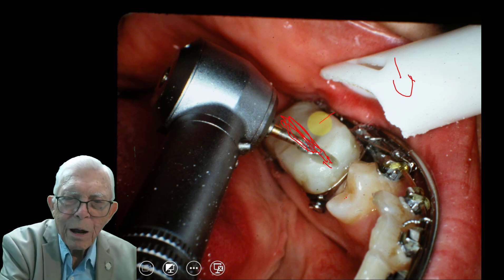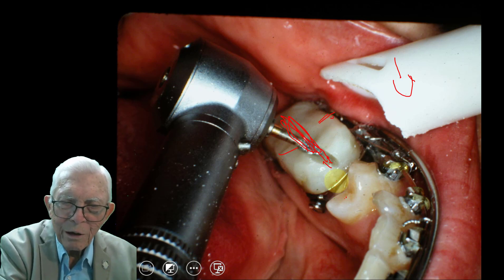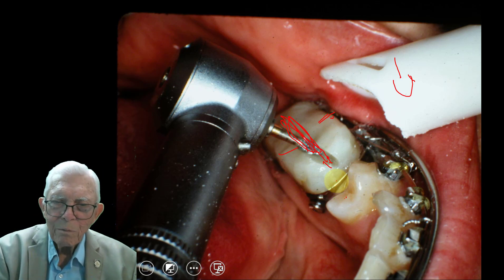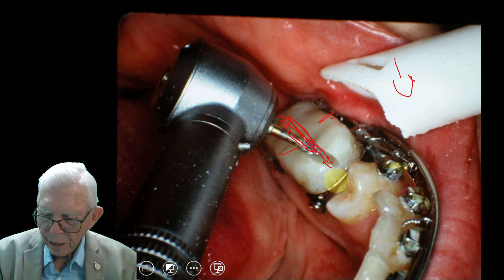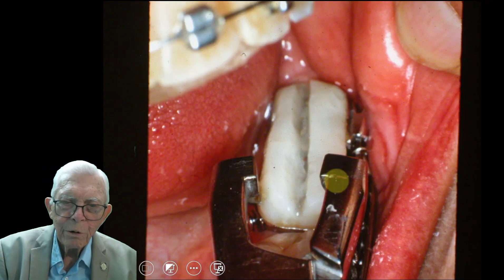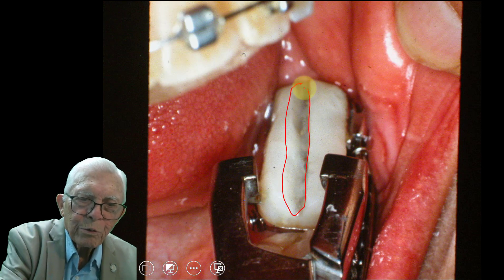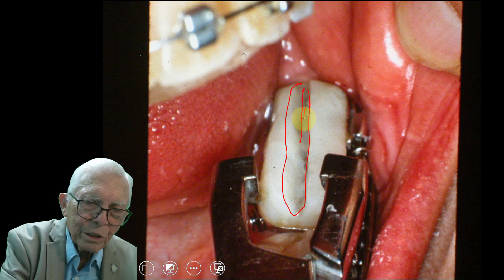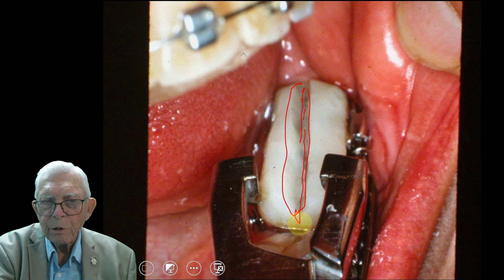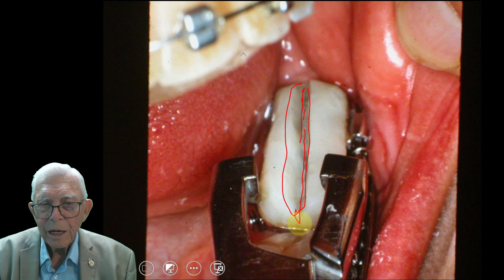Now we'll take a pair of pliers and come in on the sides. You press and you see one side give. You try to put more force on the other side while you've got both together, and you can weaken that. Here we've gone down and cut a groove through this with that barrel burr, stopping just before we touch the teeth and getting it down like that. Now we're going to put a pair of pliers and grip from the side like that.